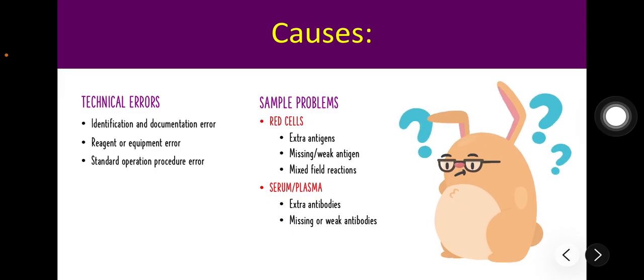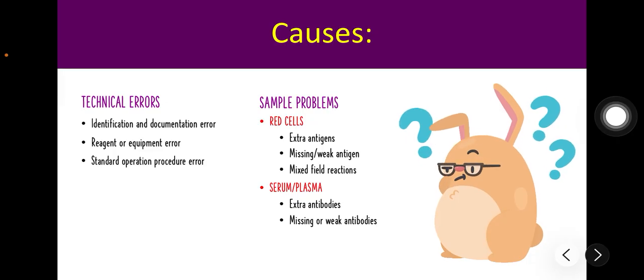Centrifugation issues: if a centrifuge is uncalibrated, over-centrifugation may cause clumps that won't disperse, which can cause a false positive reaction, while under-centrifugation may fail to bring cells together for a reaction, or a false negative. In order to reduce errors, manufacturers add blue dye to anti-A and yellow dye to anti-B, so we can easily see if the correct reagent was added.